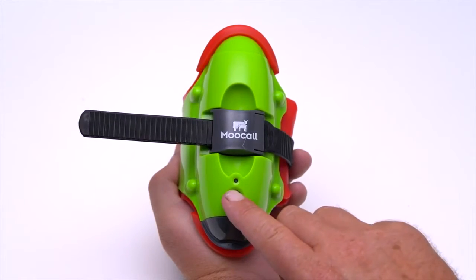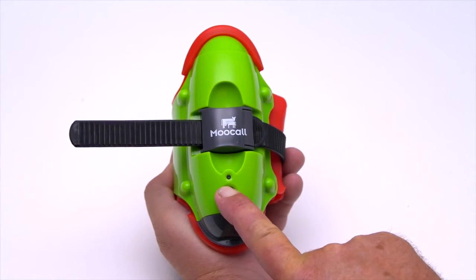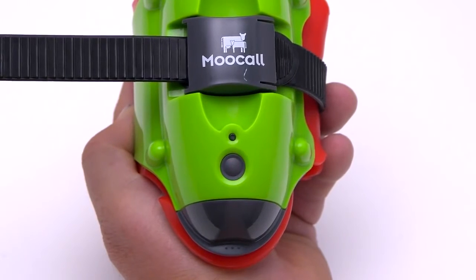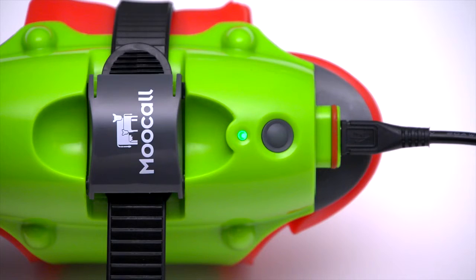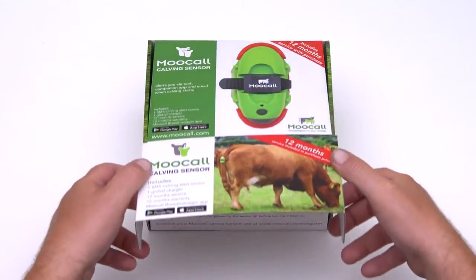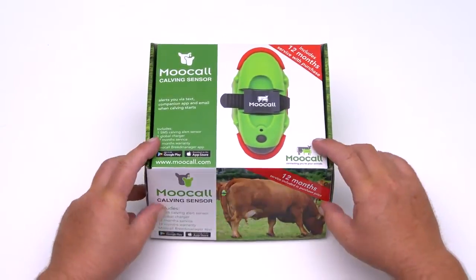To turn off the sensor, press and hold the power button for 10 seconds. The light indicator will turn pink before the unit powers down. When your calving season is over, please charge the battery to full before putting the sensor away. Storing with a fully charged battery ensures the longevity of your battery life.